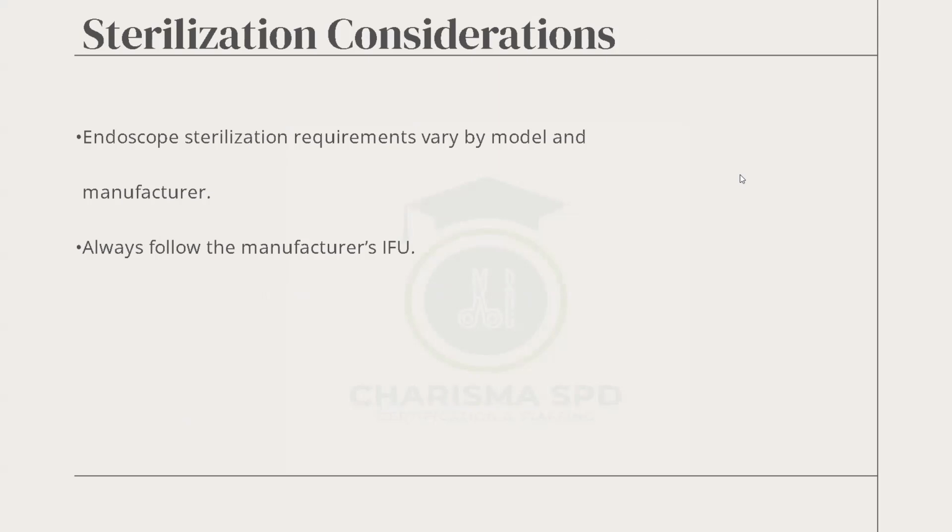Sterilization consideration. The manufacturer determines the appropriate sterilization method, whether gas or steam, and that will be spelled out in the IFU. Next slide.